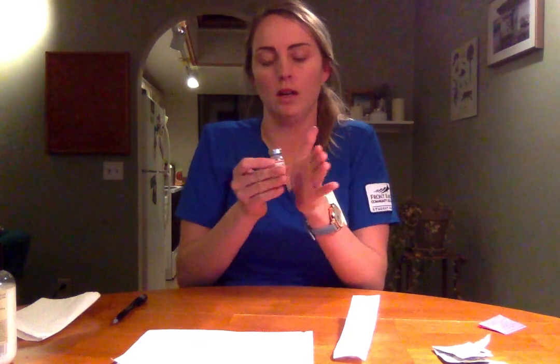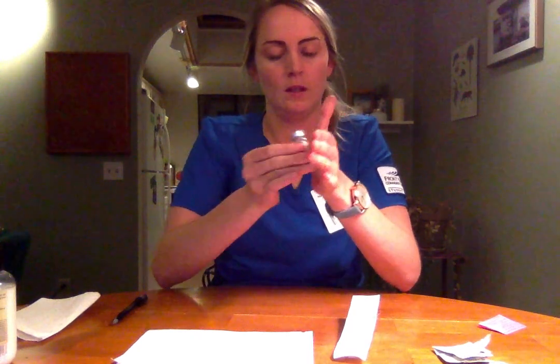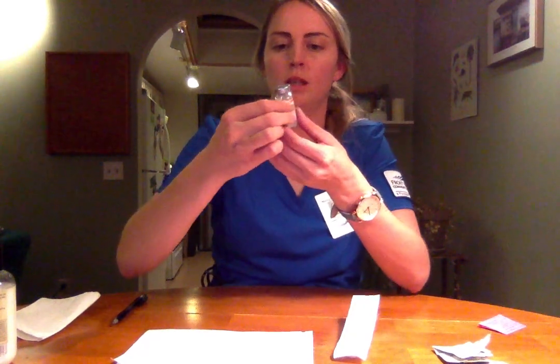So first I am going to roll the vial because I have NPH insulin. So making sure all the sediment on the bottom is mixed in well and leaves the solution cloudy. Okay, there's no sediment left on the bottom here, and it is nice and cloudy.